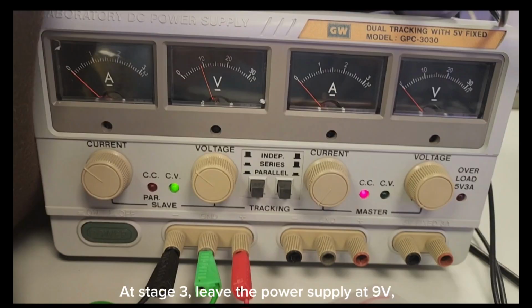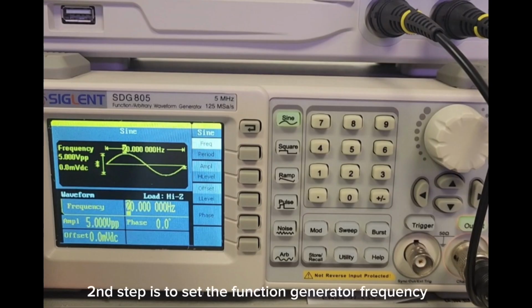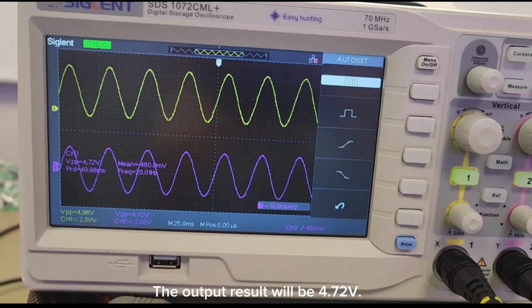At stage 3, leave the power supply at 9 volts and set the clips from the power supply to the circuit without connecting the green clip. Second step is to set the function generator to a sine wave at 20 Hz, 5 volts peak to peak. The output result will be 4.72 volts.